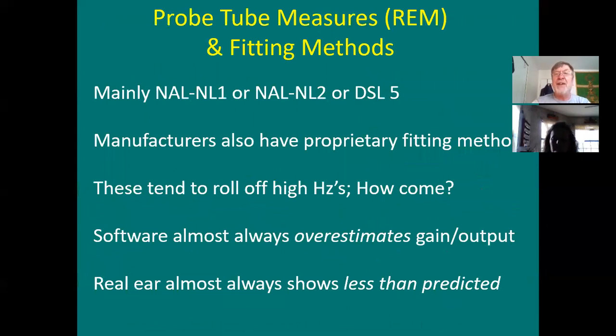Mainly the probe tube measures we use today focus on two families of fitting methods, NAL and DSL. Manufacturers also have proprietary fitting methods. They tend to roll off the high frequencies. We'll discuss next week why that is.